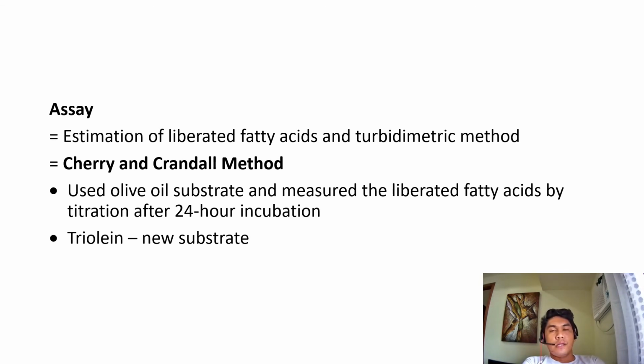It uses olive oil as substrate, and you need to measure the amount of fatty acid liberated from the substrate by titration after 24 hours of incubation. So you incubate the serum plus olive oil for 24 hours, and after that, you measure the amount of fatty acid using titration.